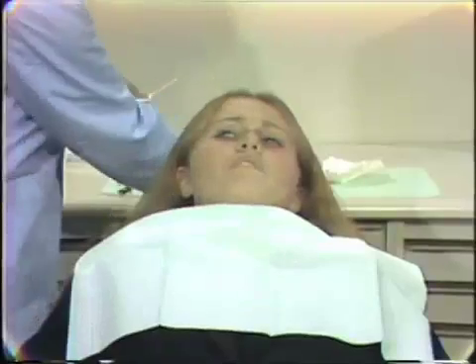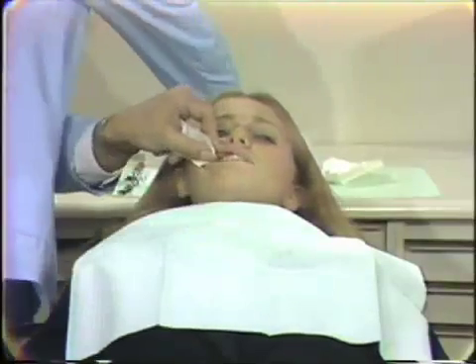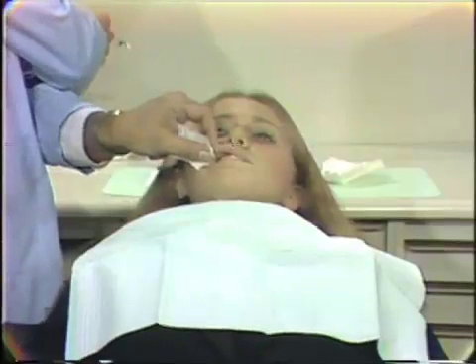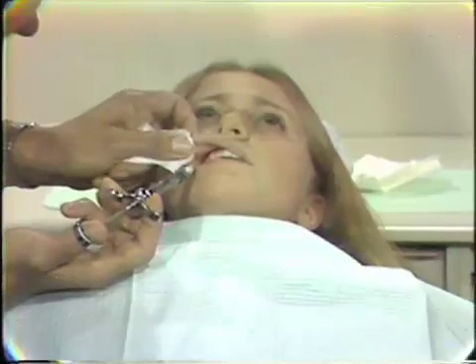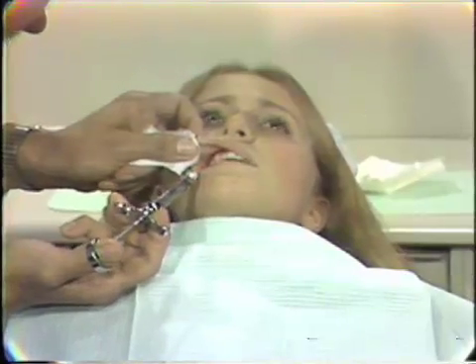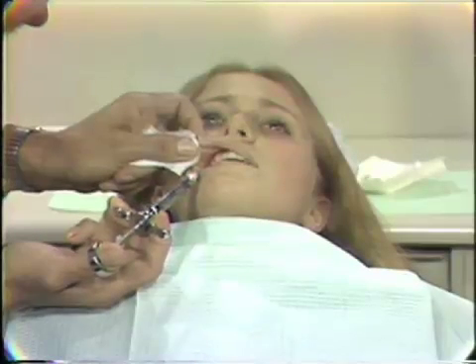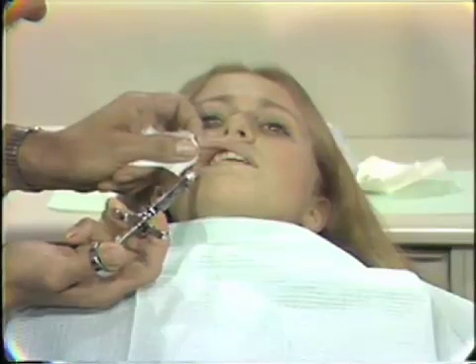Remove your cotton roll. Dry that off. Swab your site a little bit. Now without letting go of the patient, I can reach behind the patient, and merely by tipping the syringe, the tip will fall off. We can bring this in down below — the patient doesn't need to see what's going on. Then very slowly make your injection. If you watch the patient's eyes closely, you can tell whether you're injecting a little too fast. She'll squint if we inject too fast — she hasn't yet.